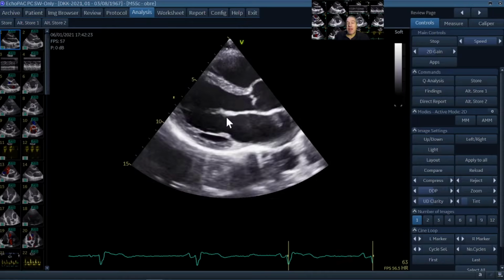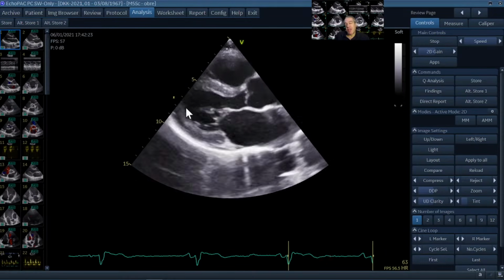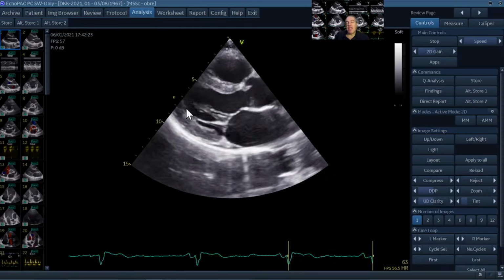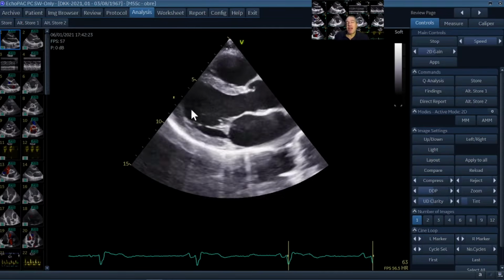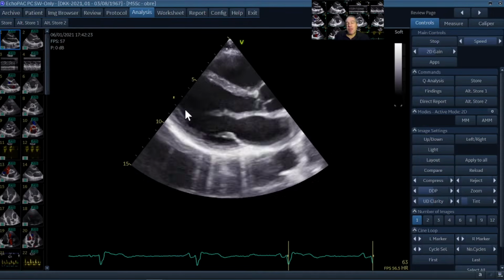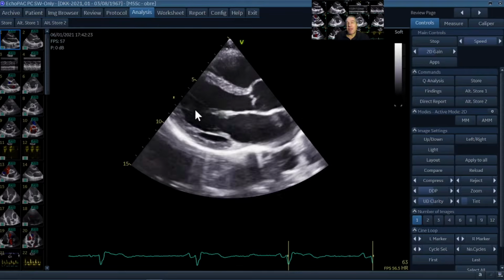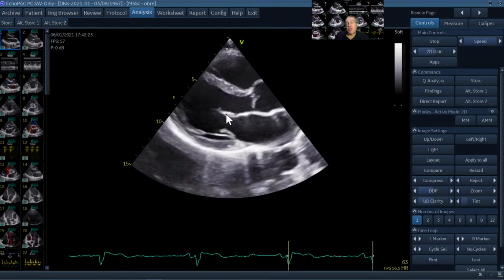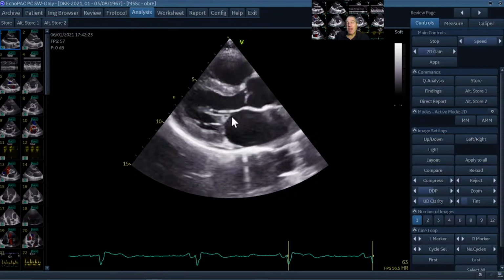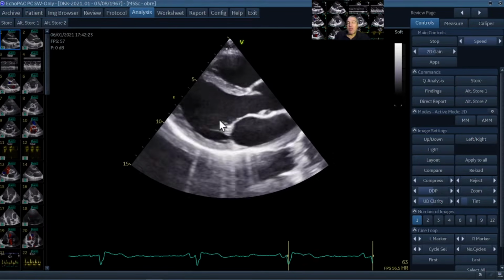So this is an anterior mitral leaflet. Here's a papillary muscle, one of the papillary muscles. I don't know exactly which one, or it's just in between. But what's important is that the papillary muscles are important to drag away the anterior leaflet more to the posterior wall.